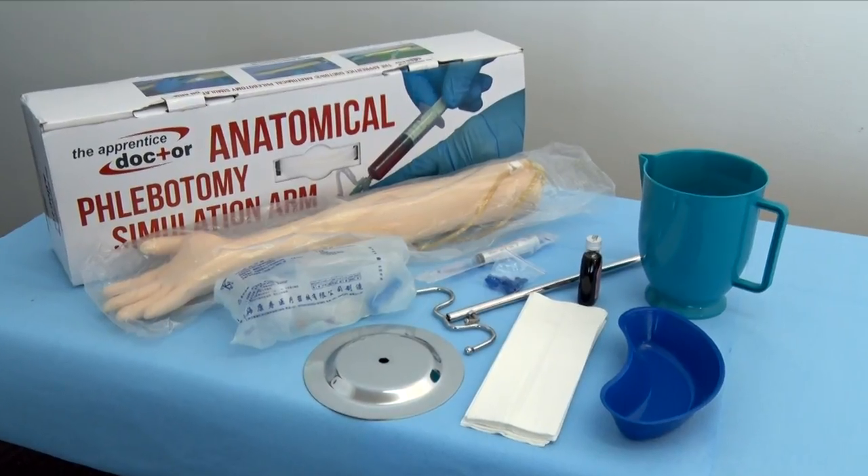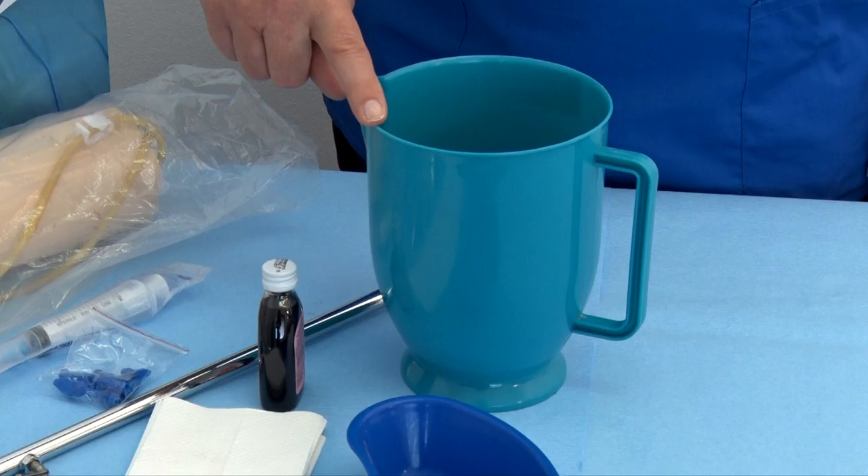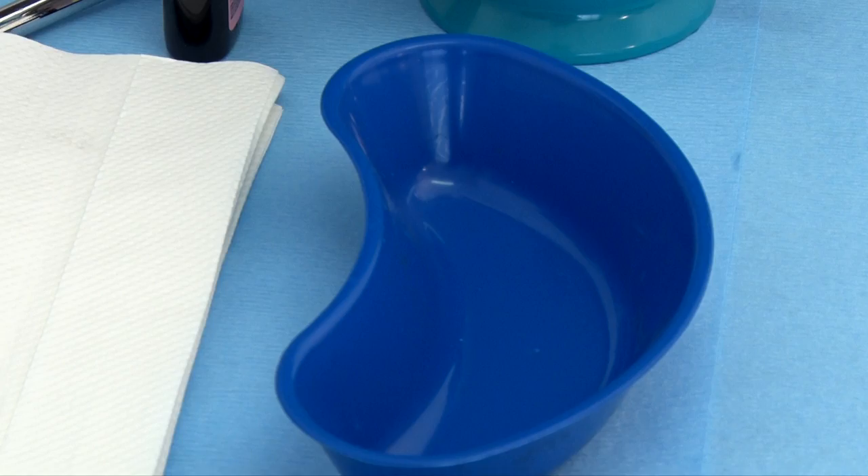The following are extra items that will be required but are not included in the box: paper towels, a large plastic container, and a smaller plastic container.